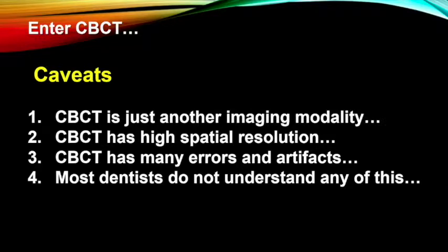You can read a book, you can buy a scanner, you can have the tech or the sales rep come in, and they'll show you how to position a patient and get a beautiful image, and then they go away. And then you go, these images are great. What the hell am I looking at? No, seriously, that is the first reaction. So there's a huge educational process that goes on with adopting this technology. There are no miracles, okay?